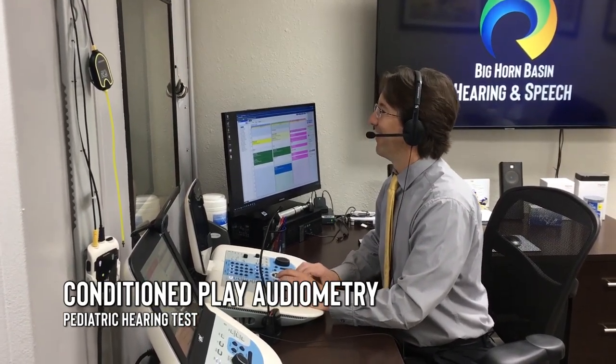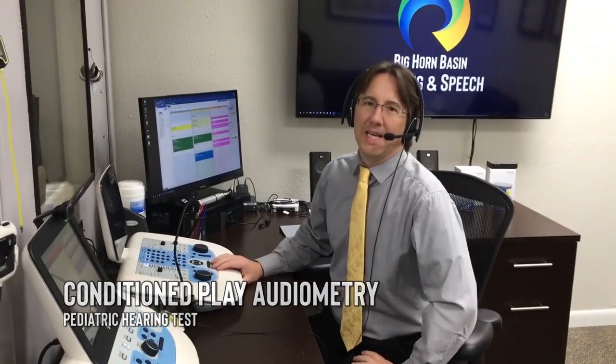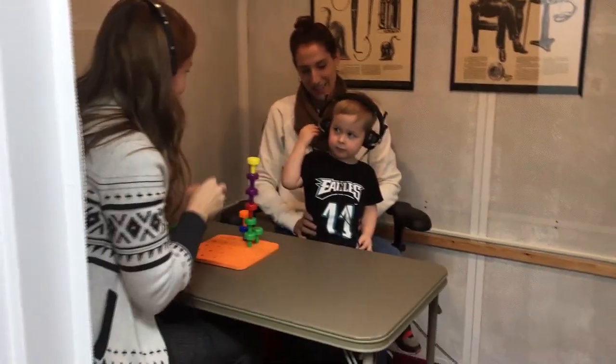We're doing conditioned play audiometry with Mr. Rex today. What we do is play a stacking game with the kids — when they hear the tone, they place a little peg on the pegboard. It's a way to test kids who are too young to reliably push a button. Go ahead and have a peek in there and we'll show you what we're doing. Listen close.